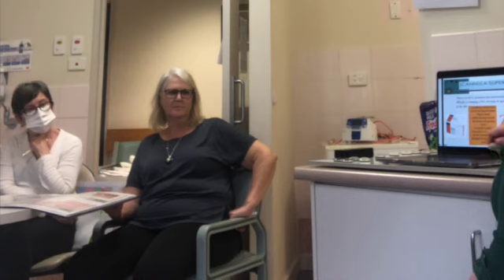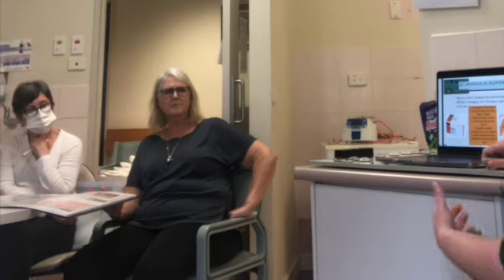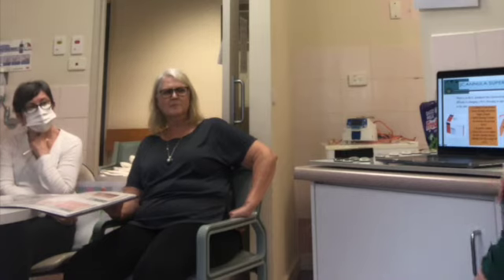Have a look at who's around. Should you accidentally bugger up and pull it out, who else can replace it for you if that happens? Or if you get the dressing off and go, oh, that's rubbish, it needs to come out, I can't leave that there, it's good to know you've got someone on that can replace it.